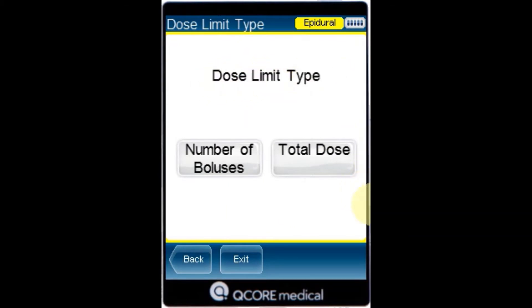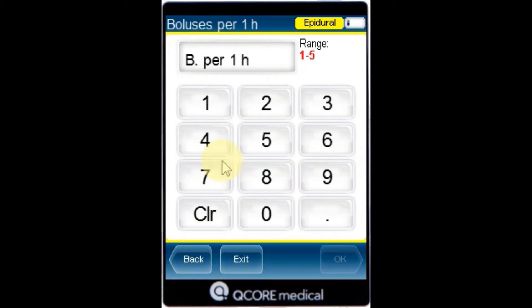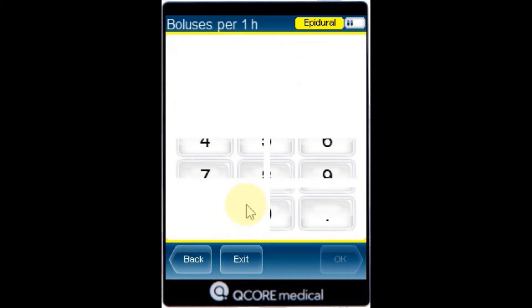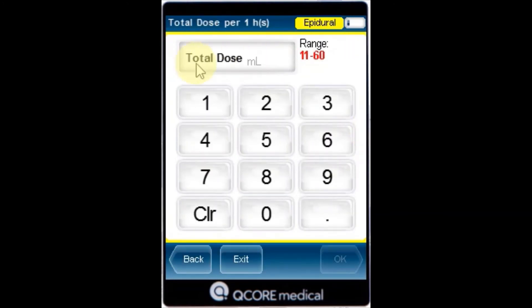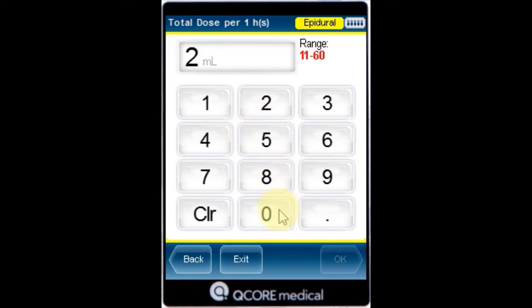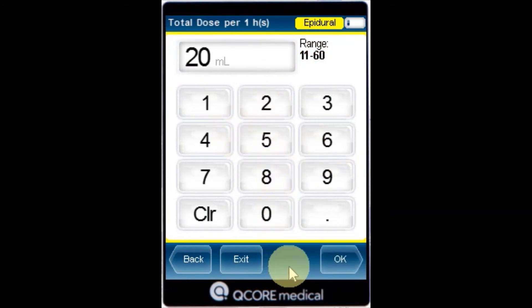Number of boluses limits the maximum number of boluses. Total dose defines the maximum amount of medication that may be delivered within a one or four hour period. After the dose limit type is selected, using the keypad enter the number of boluses or maximum dose and then press OK.